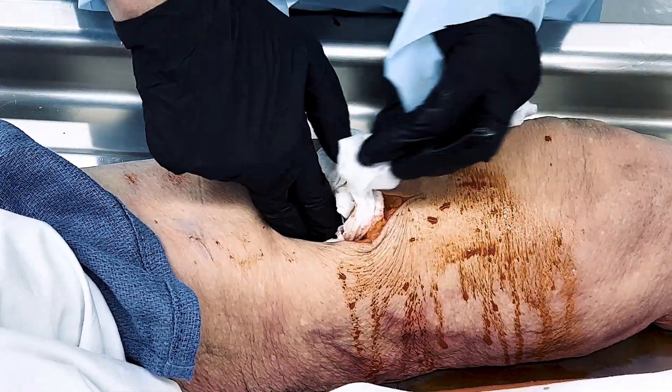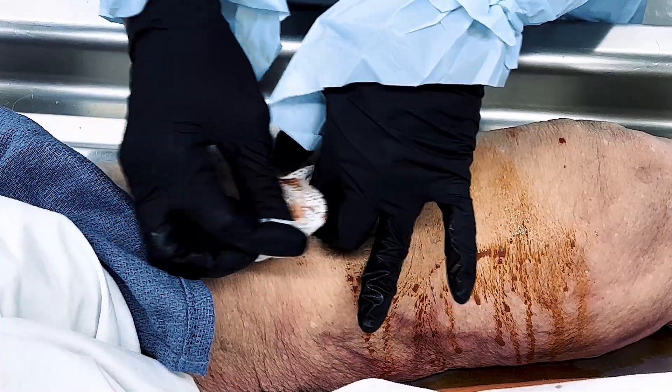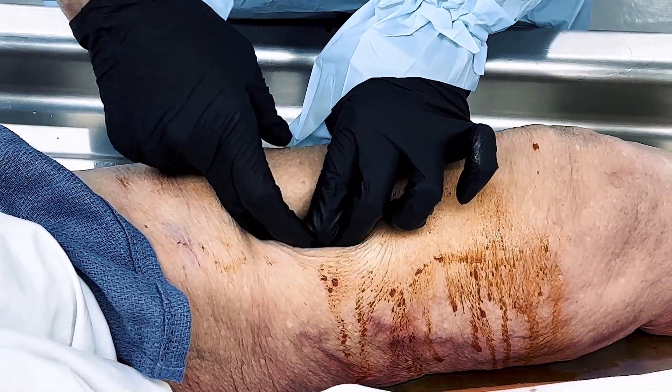Quick clot combat gauze is a hemostatic dressing used to control severe bleeding that cannot be managed with direct pressure alone. It works by accelerating the body's natural clotting process.